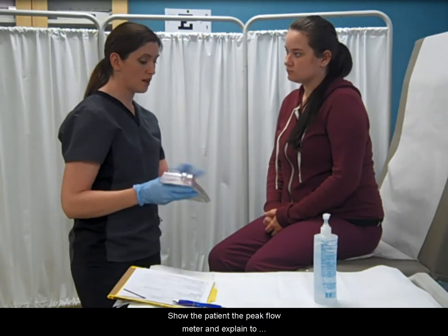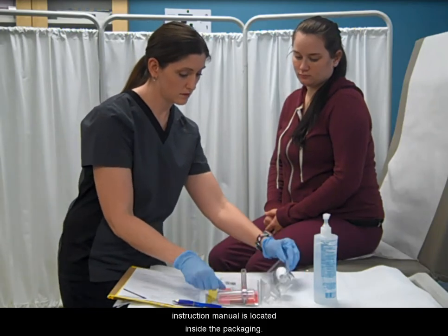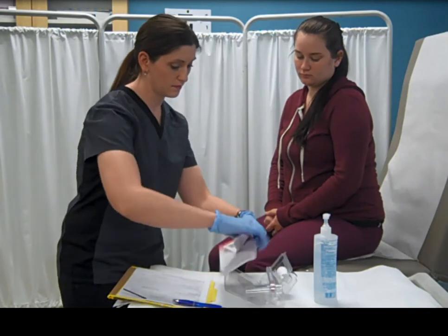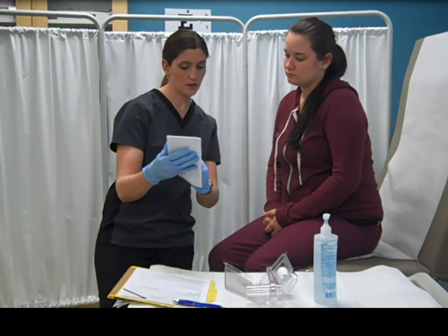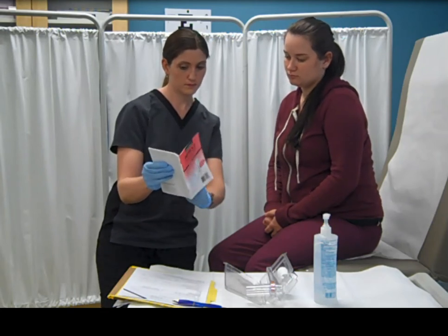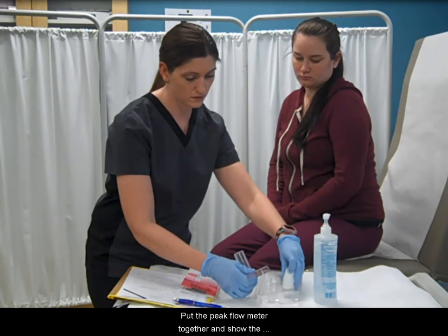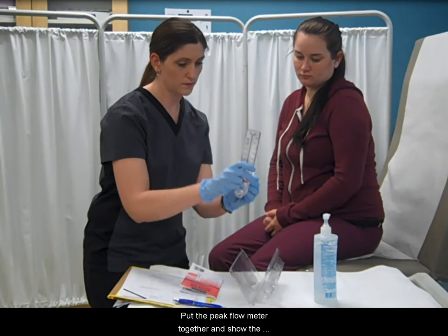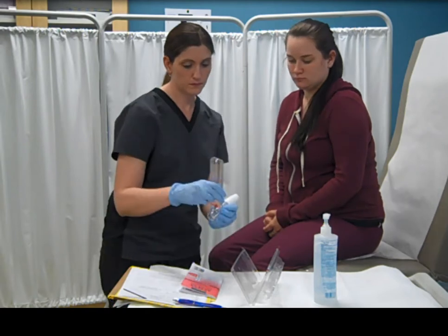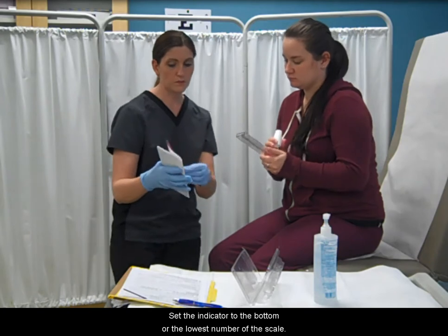Show the patient the peak flow meter and explain to them how it works. Show the patient where the instruction manual is located inside the packaging. Put the peak flow meter together and show the patient how it's done. Set the indicator to the bottom or the lowest number of the scale.